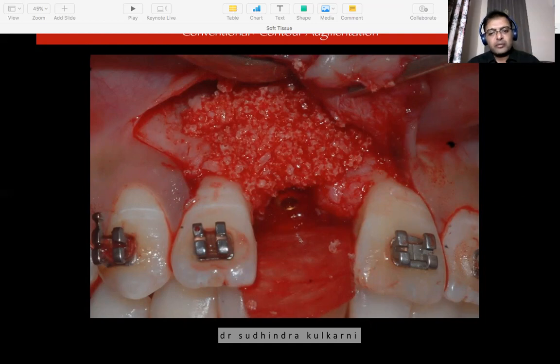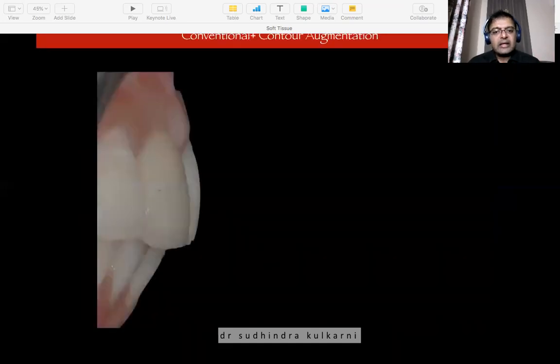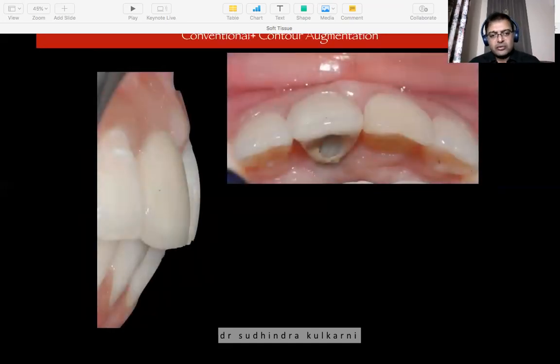The implant would survive without this, but what I would not get is an ideal aesthetic outcome. So to get an ideal aesthetic outcome, what you do is a contour augmentation. This can be done with graft materials which resorb very, very slowly, a dense graft material. When you use that and cover up, the graft material gets encapsulated and does not resorb. And by the time you restore this case, it holds up the contour and the shape.